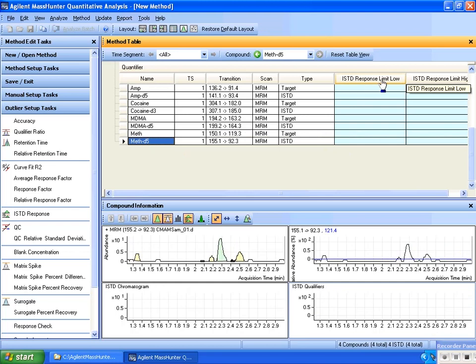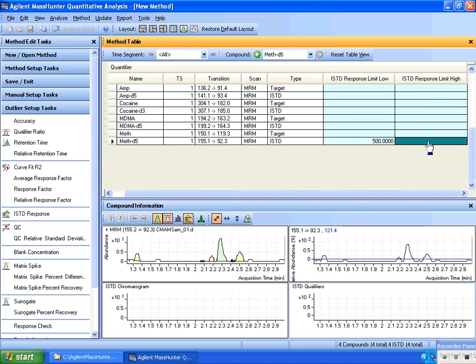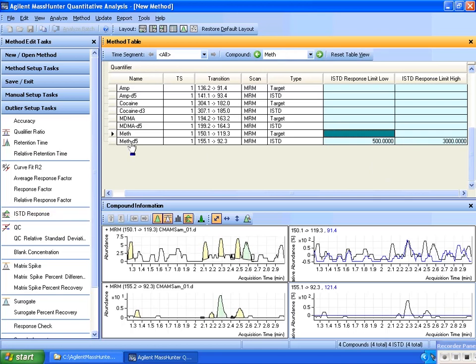And I've got the ISTD response limit low and the ISTD response limit high. So from a limit sake, I'm going to say the ISTD response must be at least 500. On the high side, I'm going to want to have the outlier detect any signal that's above 3,000 and tell me. So now that I've got my method set up with an ISTD response outlier for the methamphetamine deuterated compound, I will next apply this method and then reanalyze.